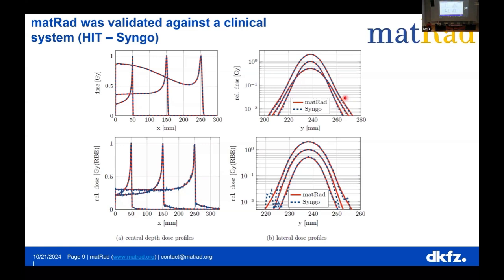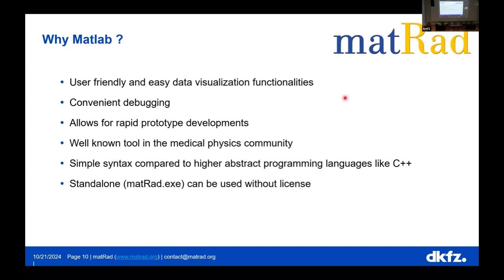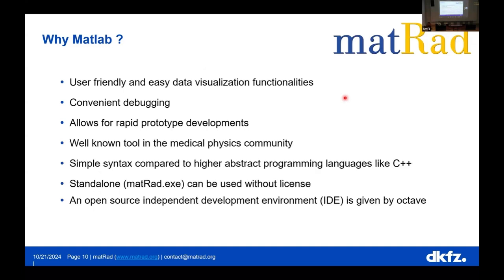Then that's just one thing. matRad is validated against clinical algorithms. So what you see is realistic in a sense, not from the clinical planning perspective, but the doses that you see are realistic. And this is a little bit about why MATLAB, but I will not go into detail here.